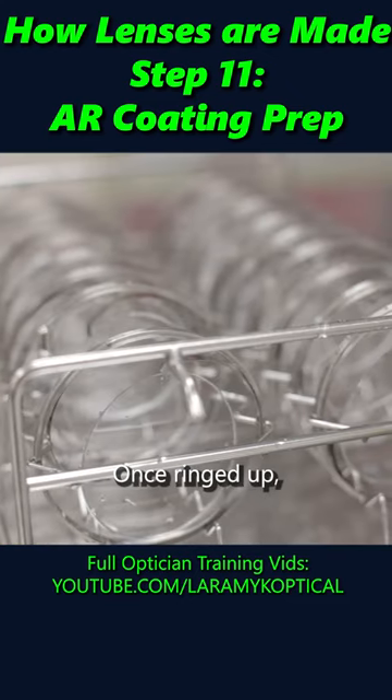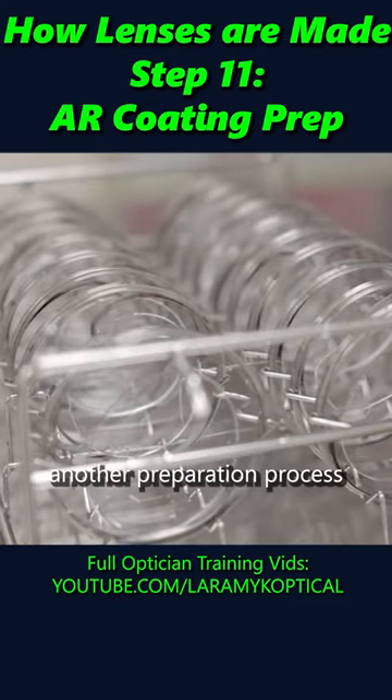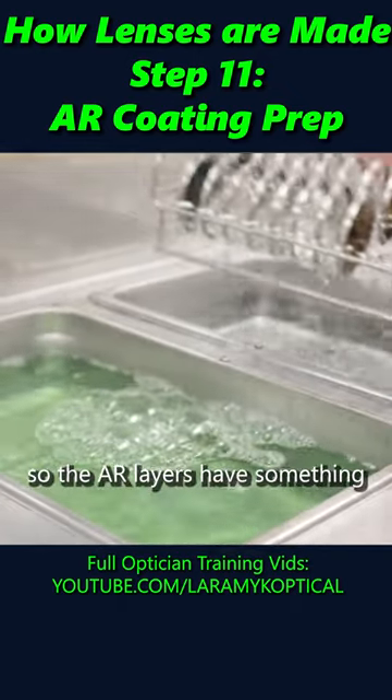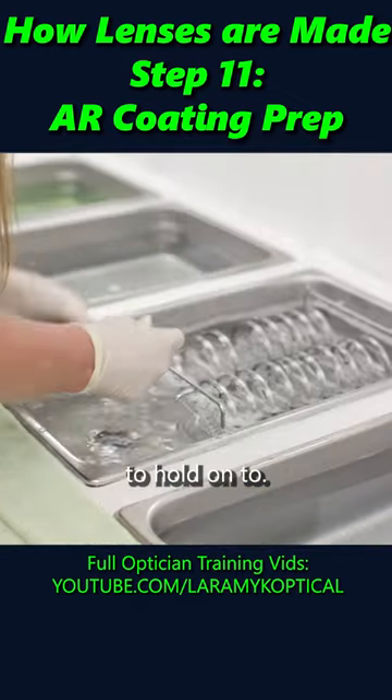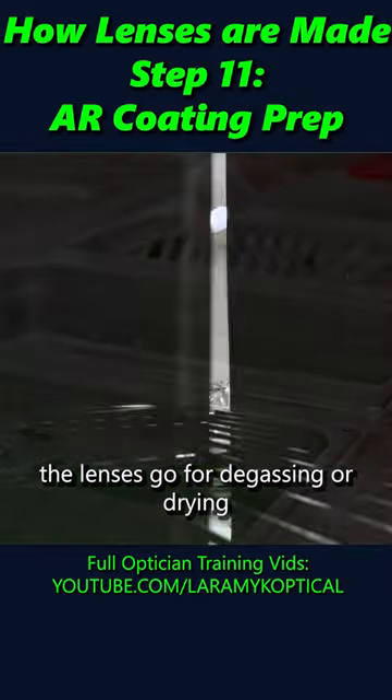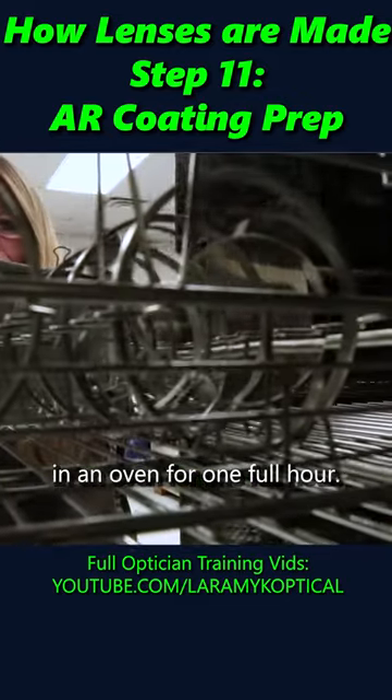Once ringed up, the lenses will go through another preparation process similar to the pre-wash. This will etch the hard coat so the AR layers have something to hold on to. After pre-wash, the lenses go for degassing or drying in an oven for one full hour.